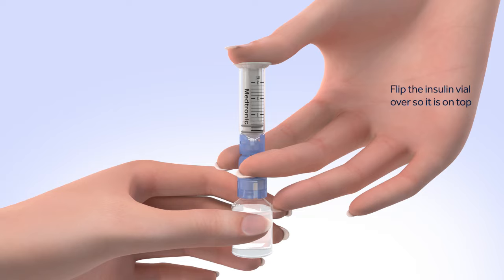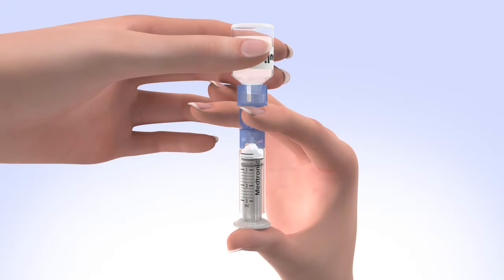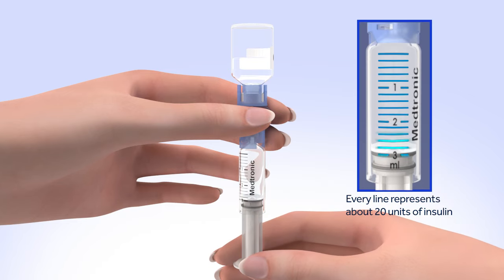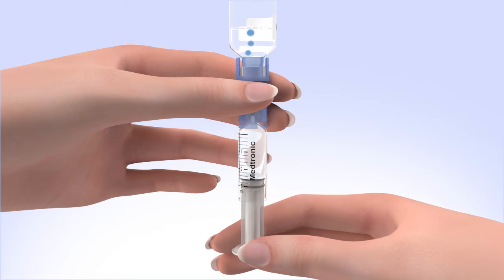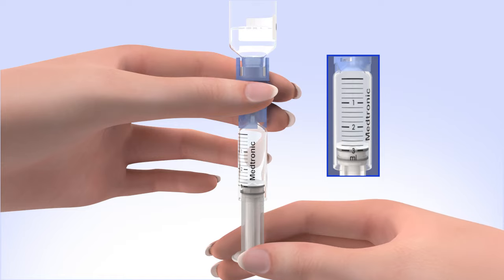Holding the plunger with your thumb, flip the insulin vial over so it is on top. Make sure you are holding the vial with your other hand. Slowly release your thumb pressure from the plunger rod, and the reservoir will start filling with insulin. When the reservoir stops filling, pull down on the plunger until the top black O-ring lines up with the desired amount. Tap the reservoir hard enough to make the air bubbles rise to the top. Slowly push up on the plunger rod to move the air bubbles back into the insulin vial. Pull down on the plunger to fill the reservoir to the number of units desired. Repeat as needed until air bubbles are removed from the reservoir.